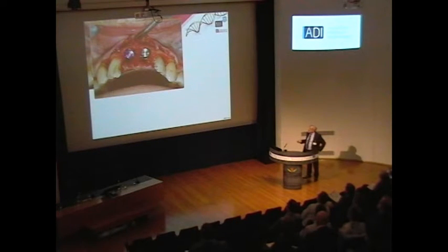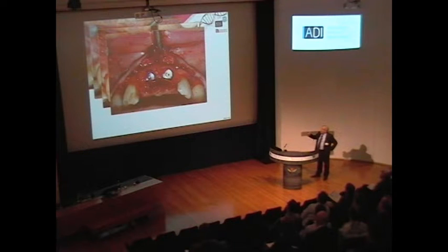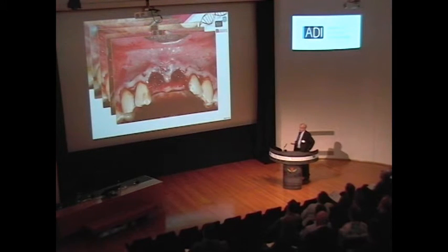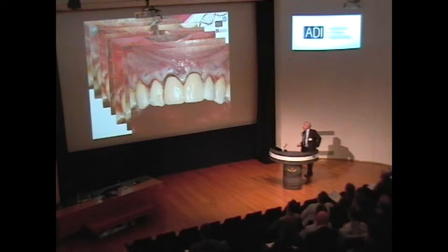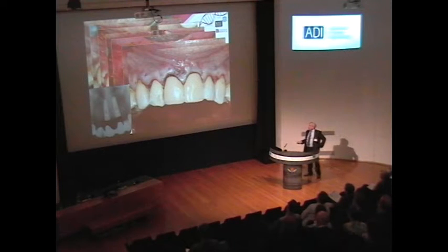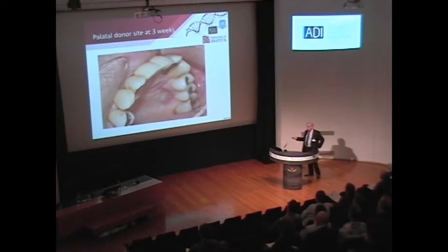Implants are placed palatally, and now we will see that the granulation tissue from the pocket lining has been all preserved, because it is going to be utilized in our wound coverage. So up under there is our connective tissue, same method as before, and it's all sewn together. Temporary adhesive bridge is placed in over the top, protecting everything, no extra pressure onto those tissues. And 3 weeks later, it's looking like that.